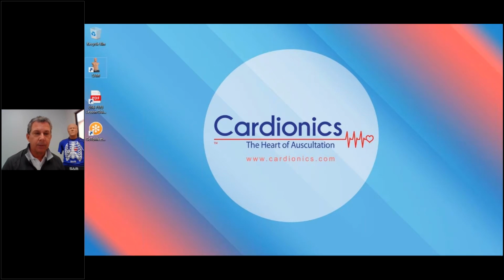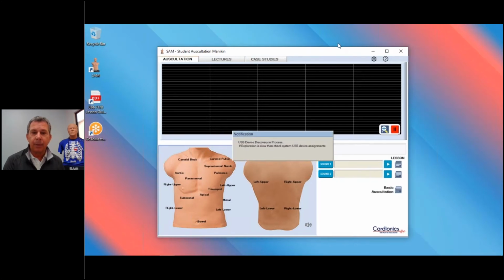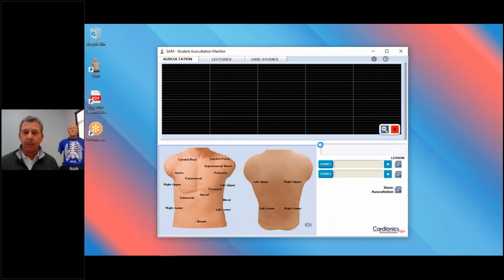I should also tell you that the components with SAM are the actual mannequin, and then I am presenting from the SAM laptop that comes with SAM3G, and that has the software on it. So I'm going to right now share my screen and then open up the software. So you'll click on SAM, the icon, and this is the screen that you'll see. It's just going through its warm up right now. But yeah, so here we are.